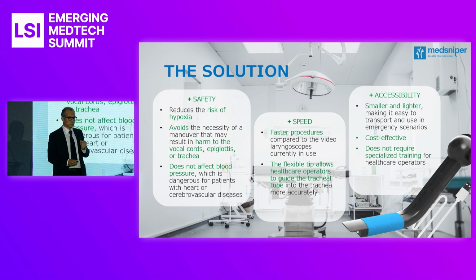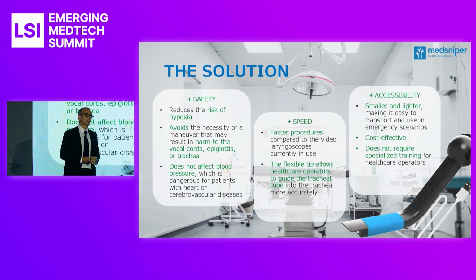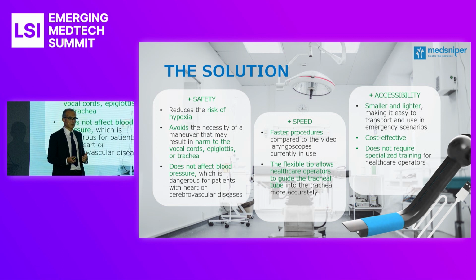So you do not have to stretch the patient, you do not have to damage the teeth, you do not have to damage the neck, you do not have to have a rise in arterial pressure, which is another important thing. Because, as you know, you can have a high arterial pressure, but if you had an accident, maybe your hemorrhagic situation would be worse.